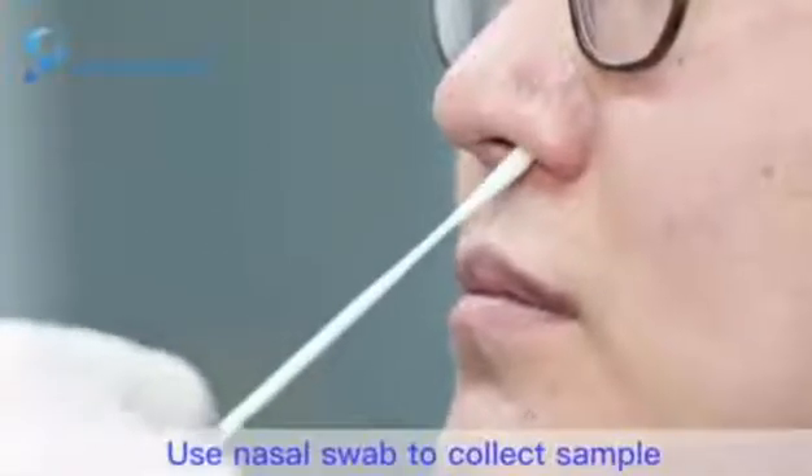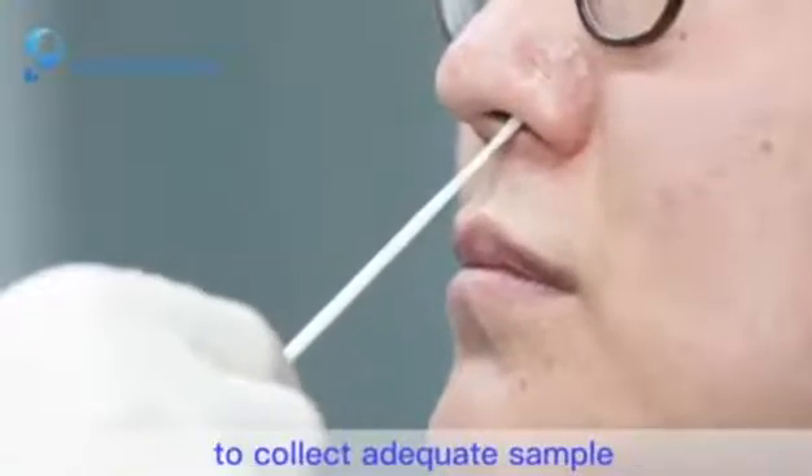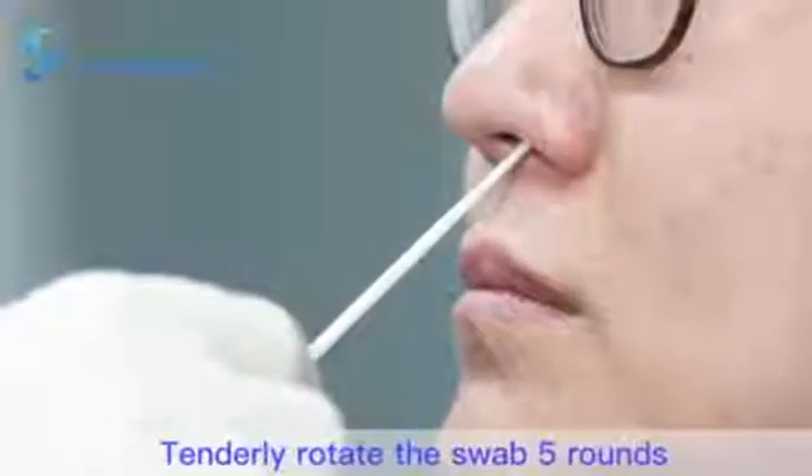Step 3: Use the nasal swab to collect a sample. The swab should go down to the nasopharynx to collect an adequate sample. Tenderly rotate the swab 5 rounds.